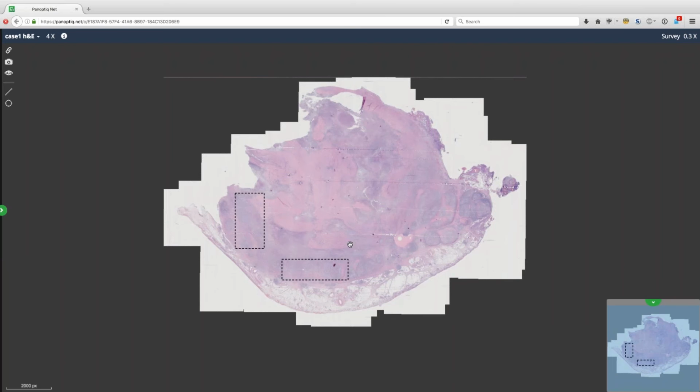Now, when I present my cases, some of the things that I would like to point out to the members also is the difference between what I could have done with the traditional way of doing things and the digital way of doing things. In traditional cases, if I had a camera attached to a microscope that was taking still images, there was no way that I could have shown this wide a field of tumor, and this is predominantly a solid lesion. That's something very important to convey to the surgeon. So this was a solid lesion.